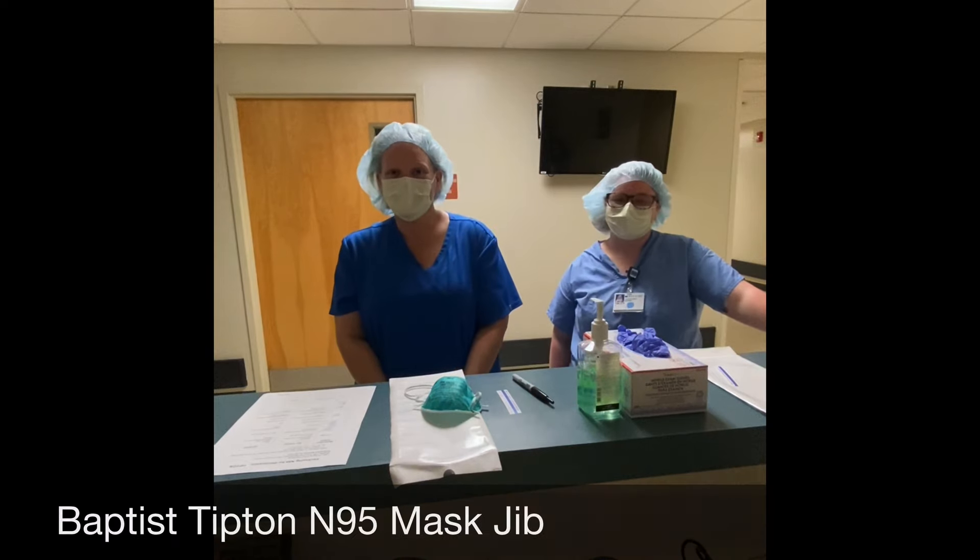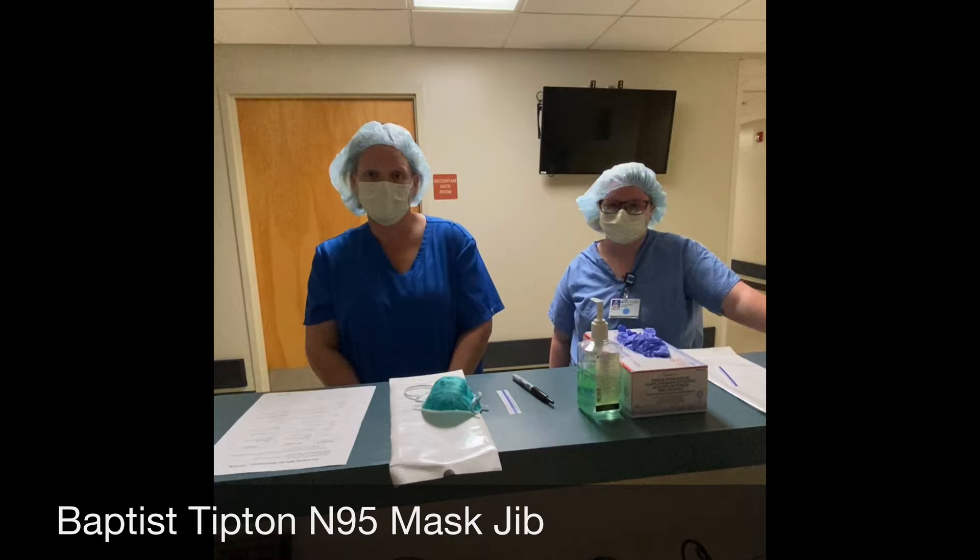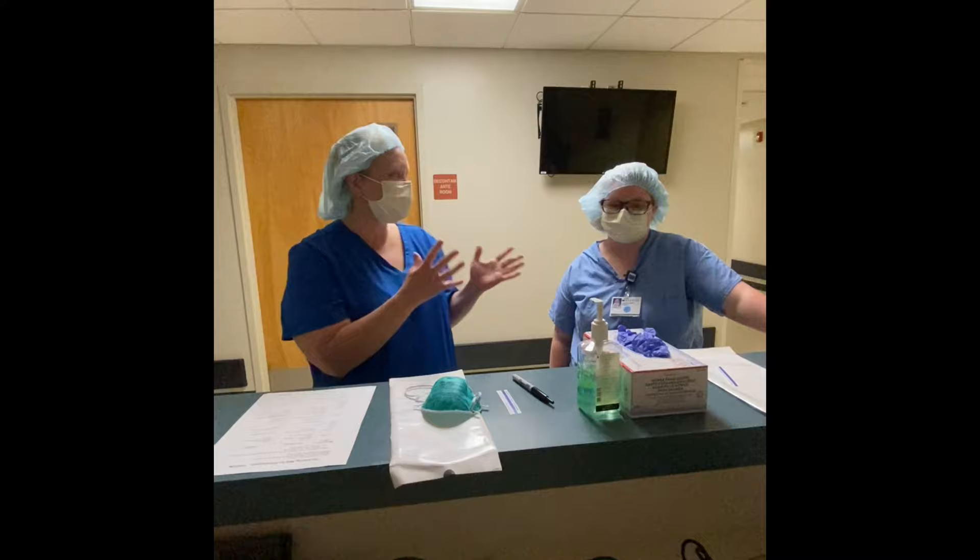Hi, my name is Kim Strickland and I wanted to take a few minutes to talk with you about how to package your N95 for sterilization. We are going to go through all of the different steps, and Ms. Haley is going to learn them and then demonstrate it back for you.